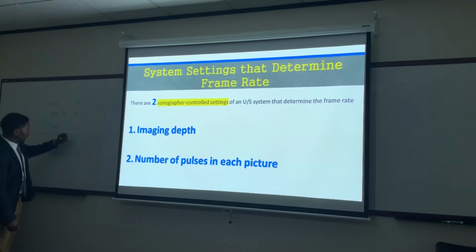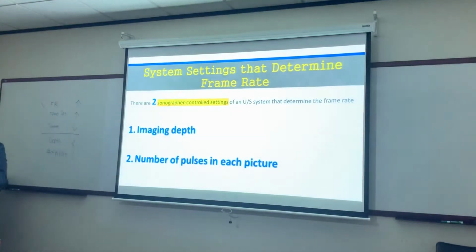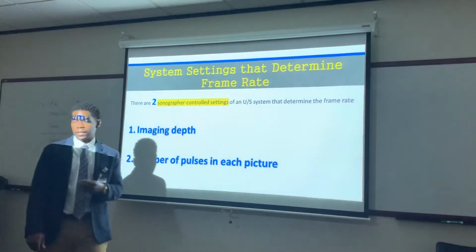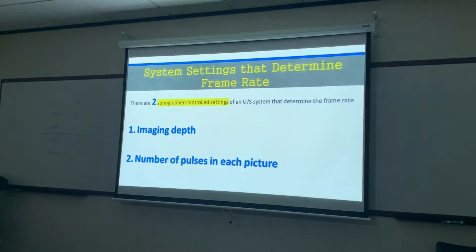Okay, so I'm going to draw my arrows down right here. I like summarizing stuff up like this. Just like I said, understanding those relationships. Probably after I get through the lecture, you guys read it a second time, it'll come real quick. Okay, so let's talk about imaging depth.